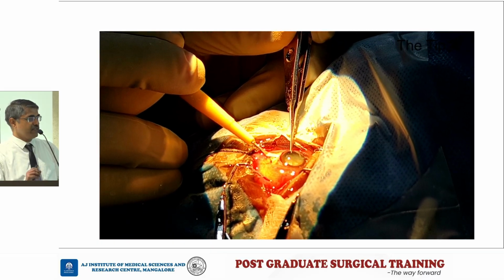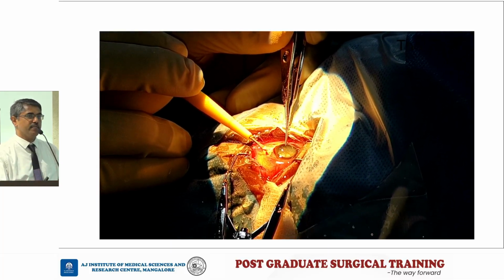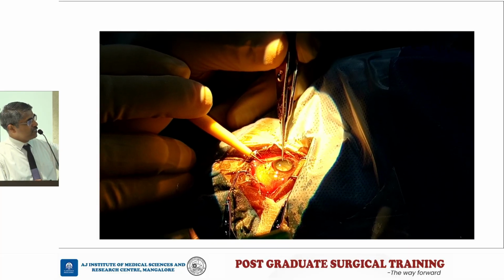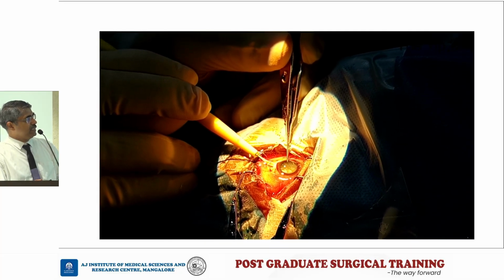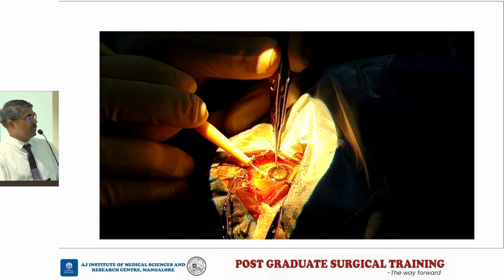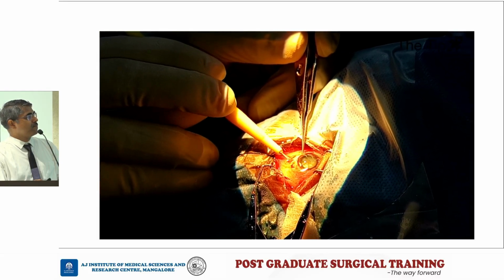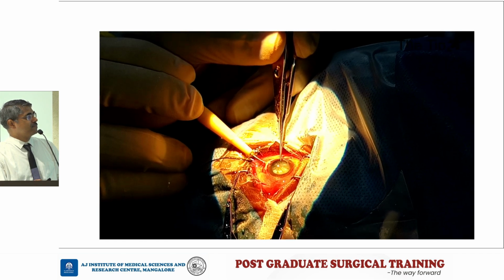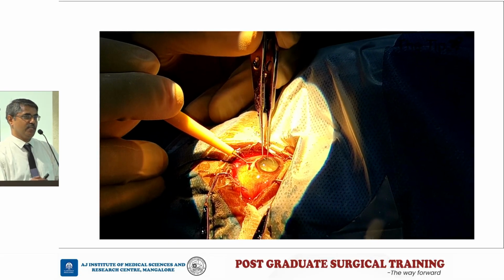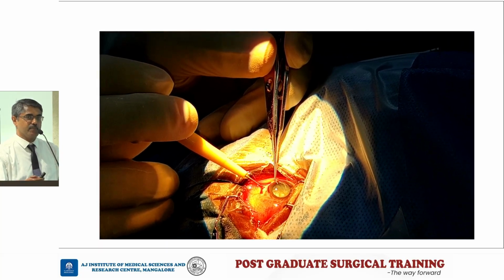Now when you go in, you feel your muscle, more than what you see in the wound, you feel your muscle and it imitates the same movement, and you are in the correct plane when you do the whole dissection. Just see how curved the globe is, how much it has to tilt to dissect the plane correctly. This is very difficult to teach with any number of words to a PG, but if they can do this exercise, they will be teaching themselves when they'll be learning this.